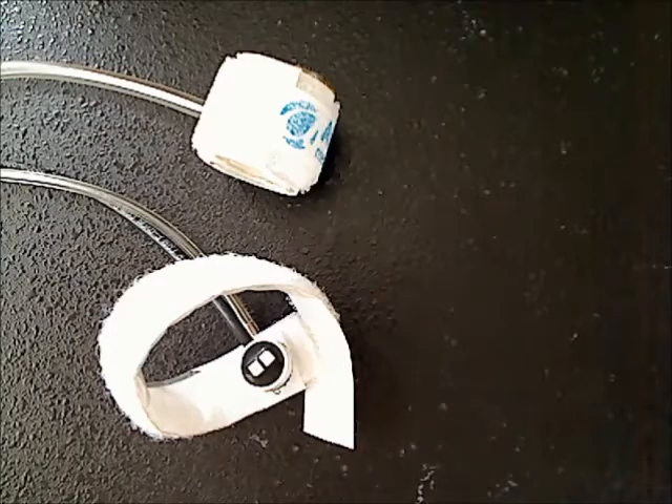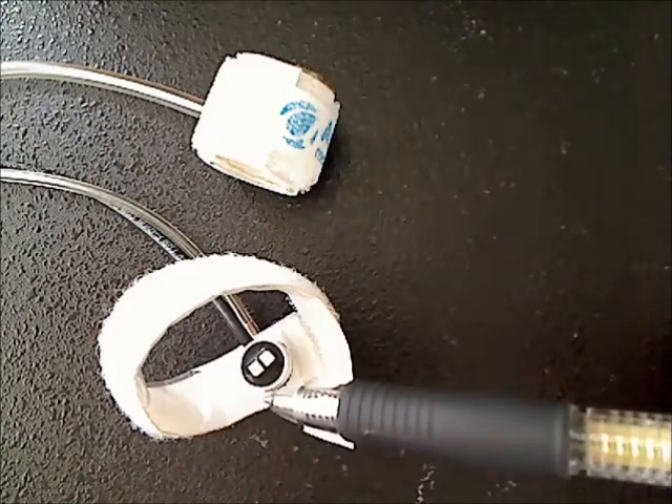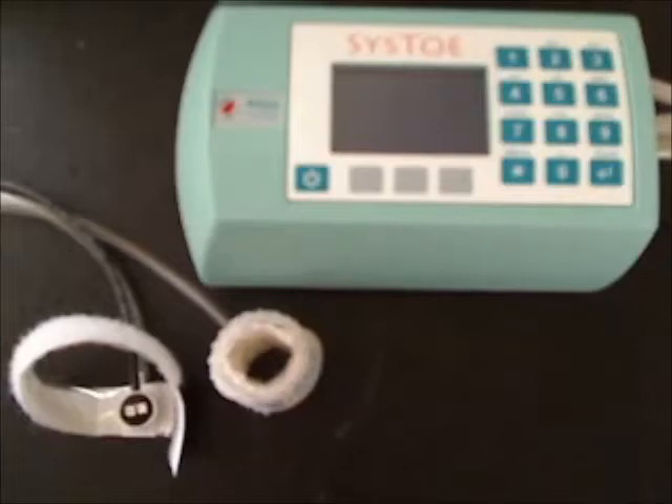The SysToe comes with two cuffs: the occlusion cuff and the sensor cuff. The occlusion cuff stops the blood flow. The sensor cuff empties the tip of the toe — it pushes the blood away. When the tip of the toe is emptied, it is easier for the sensor to detect the return of the blood flow.